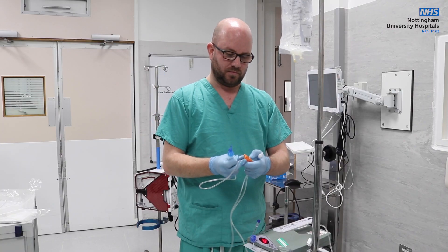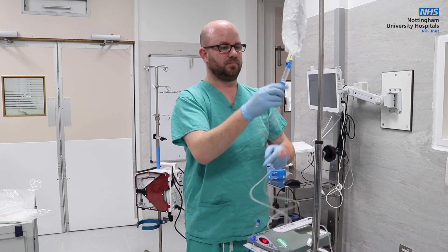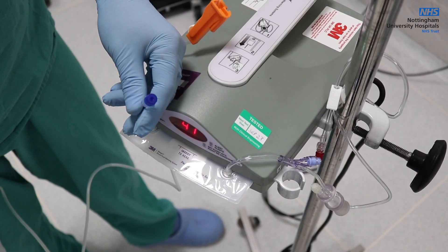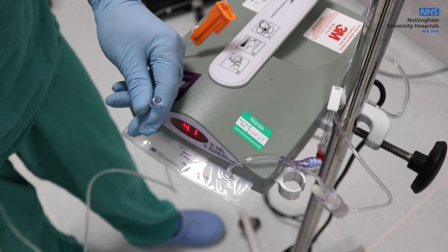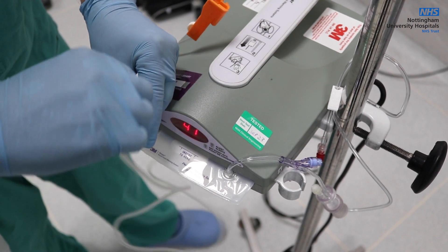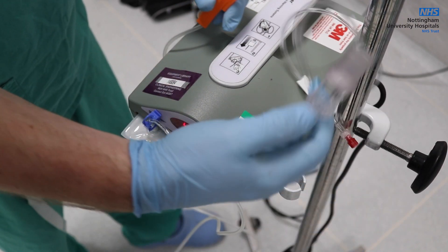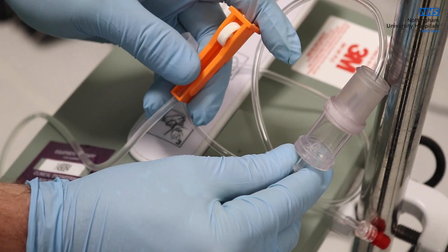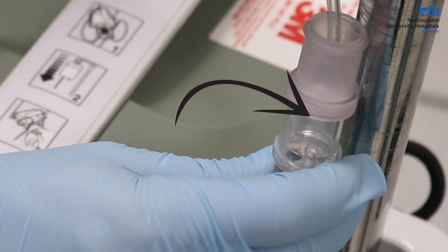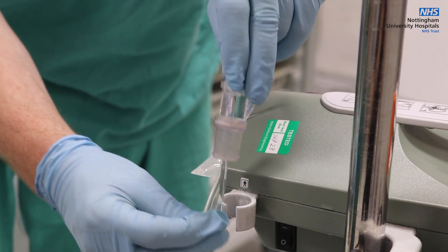The IV fluid or blood enters the insert via a standard fluid or blood giving set. The giving set is connected to the insert via the short tubing with the blue cap. The fluid is then run through the line into the insert. The bubble trap is held upside down until the fluid flows into it. Once the fluid reaches the line near the end of the trap, indicated here, it should be turned to the correct orientation.